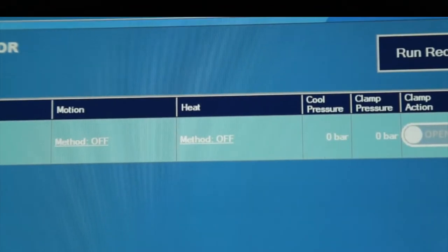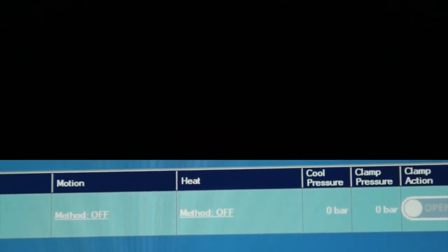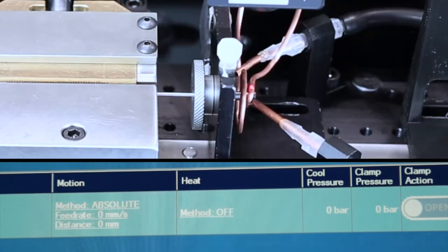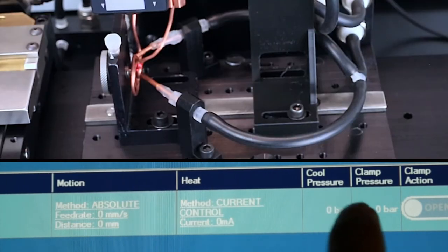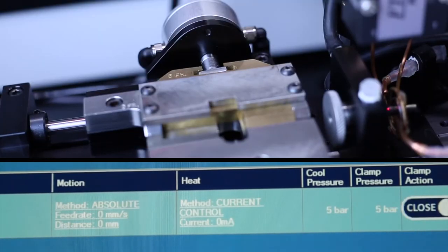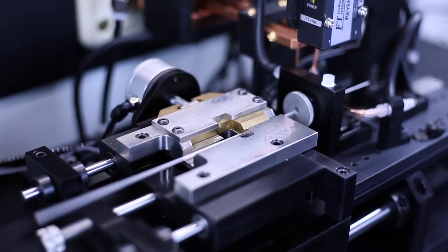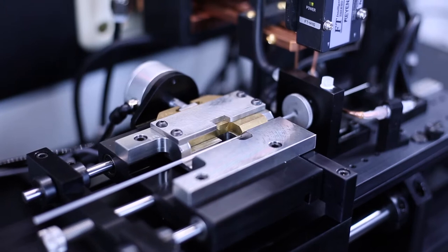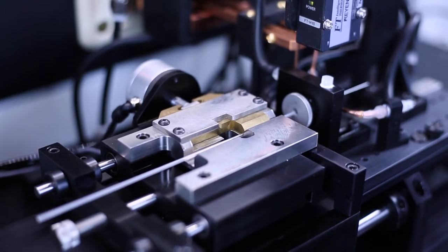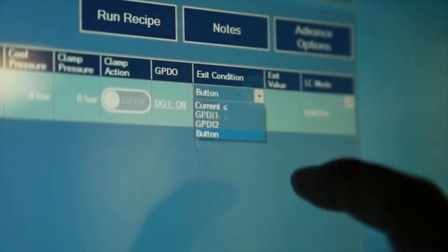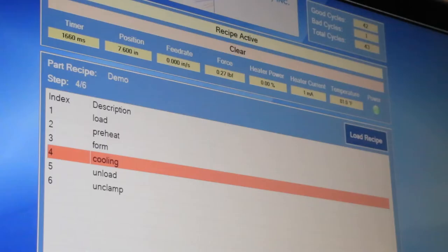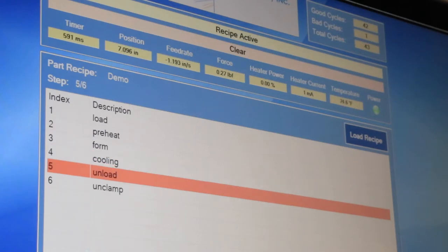An action is an output generated by the Magnum, such as motion, heat, cool pressure, and clamp actuation. You can have multiple actions run simultaneously during a step. An exit condition dictates when the step is complete and ready to advance to the next step.